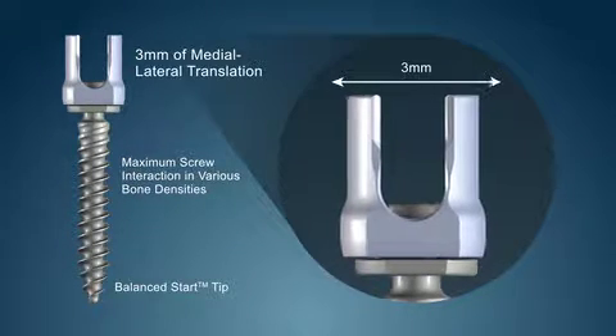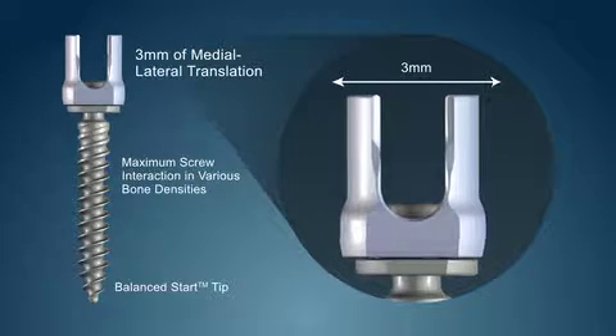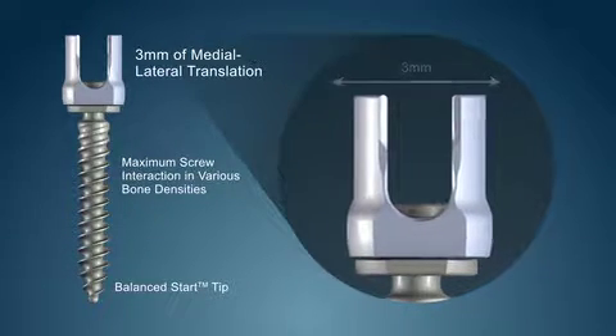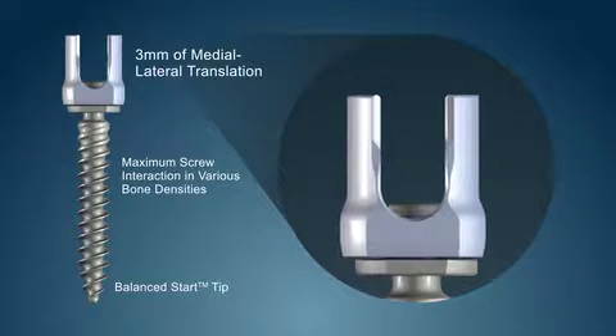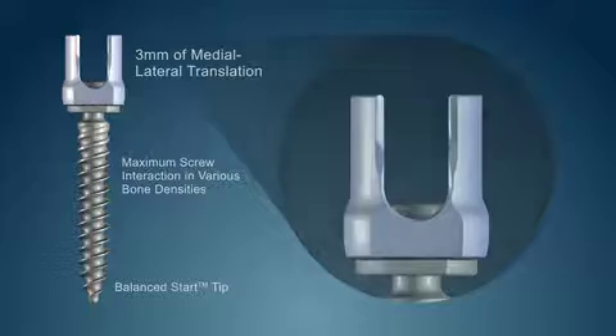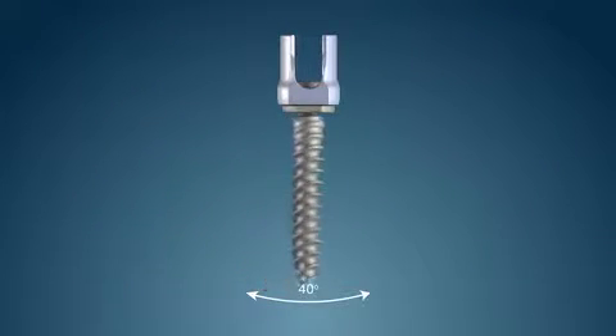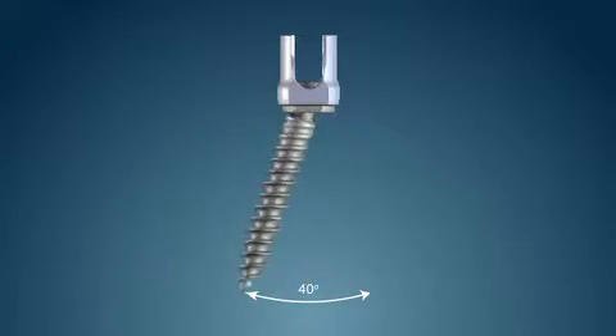The Polaris screw, featuring the translation technology, allows the screw head to translate up to 3 mm medial lateral relative to the screw shaft, and has multi-axial capabilities, allowing up to 40 degrees of conical angulation.